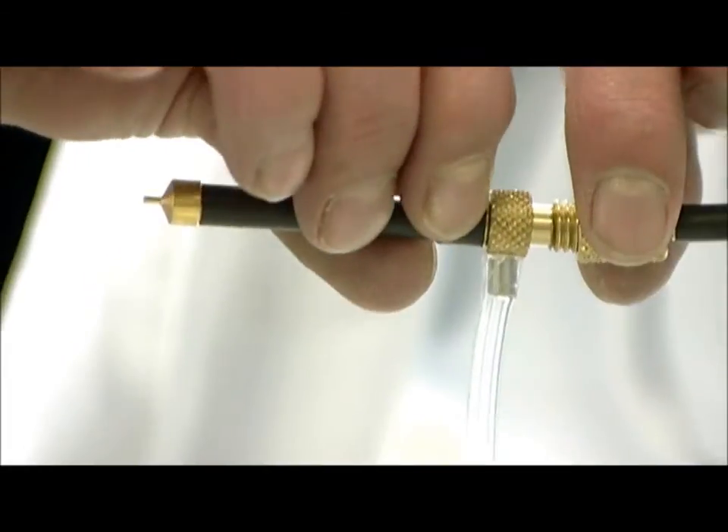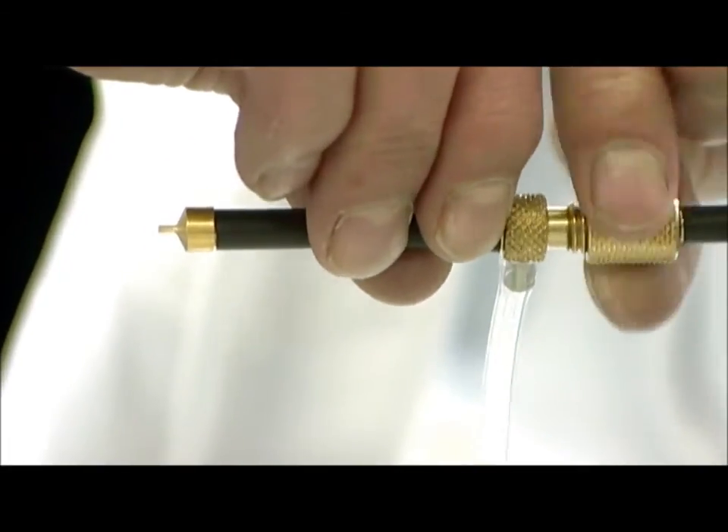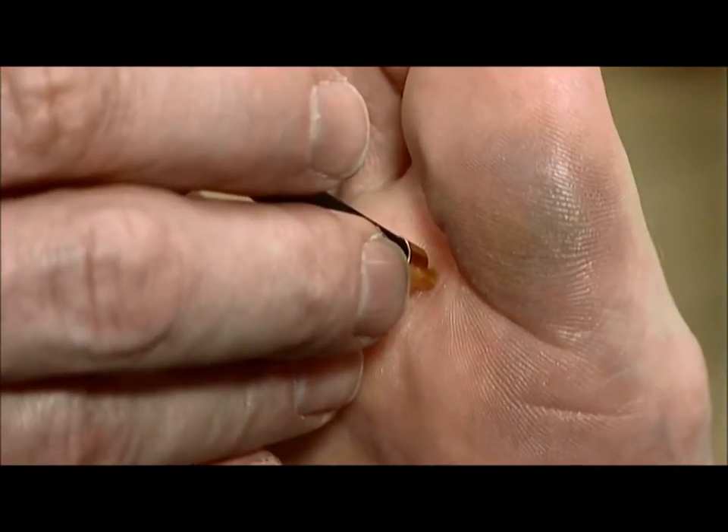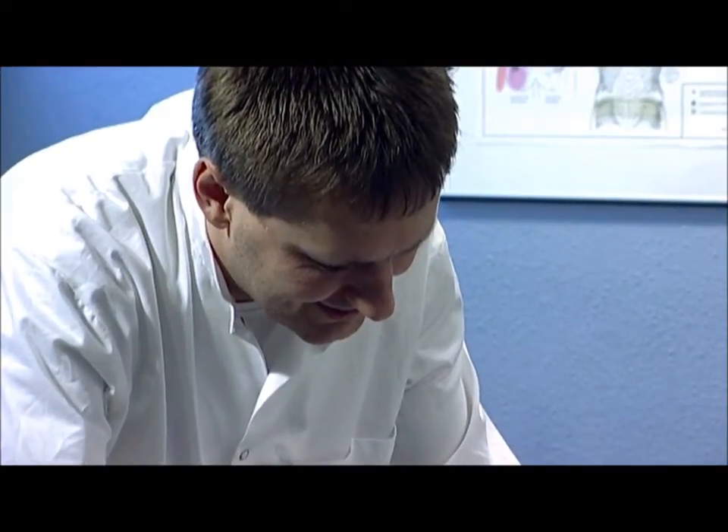For contact freezing, a range of so-called contact probes is available, from sharp pointed to three centimeters in diameter. All contact probes are equipped with a silicone tube directing the exhaust gas away from the patient. This method makes use of a super-cooled metal tip which is pressed against the lesion.